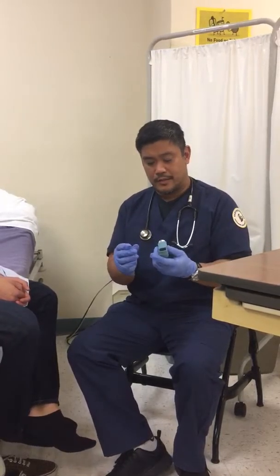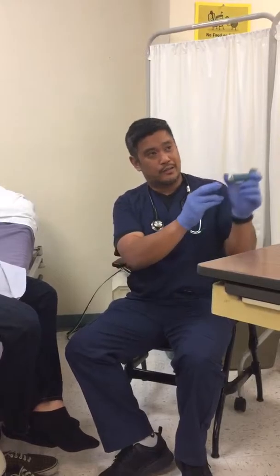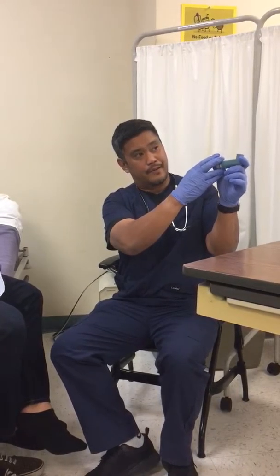Remove the mouthpiece. Sometimes there is buildup inside, and you're going to want to prime this, just to remove the dust and dirt that might build up. So you're going to want to shake it. It's also good for mixing the medication. And you're going to want to actuate it up in the air a couple of times just to blow away any kind of dust that might be building up there for you.